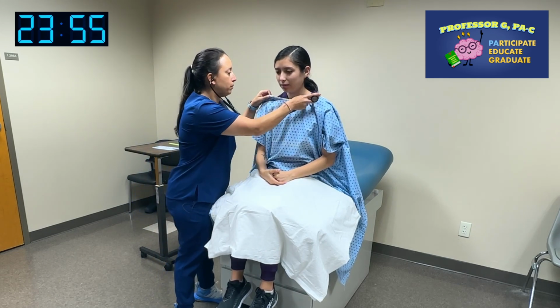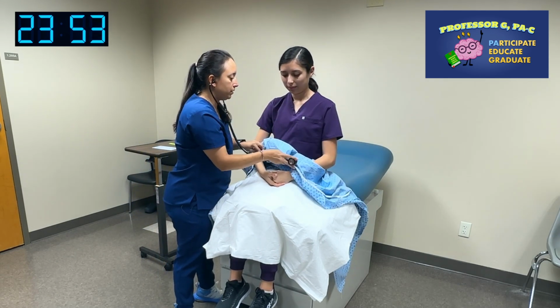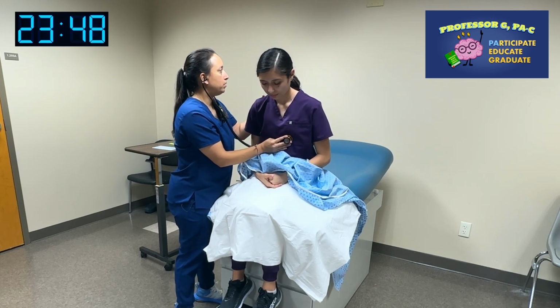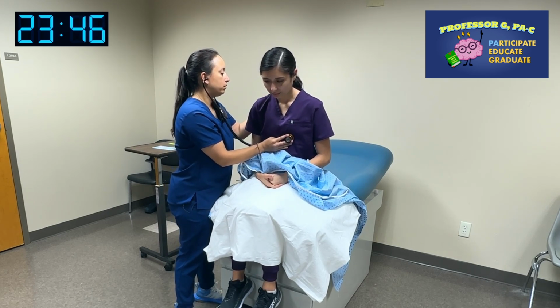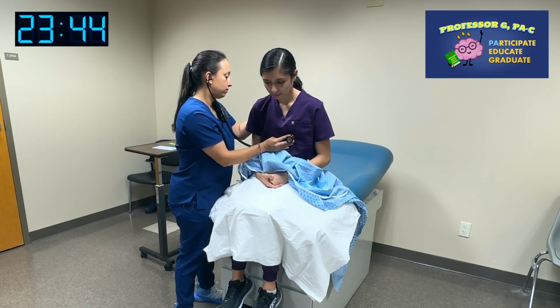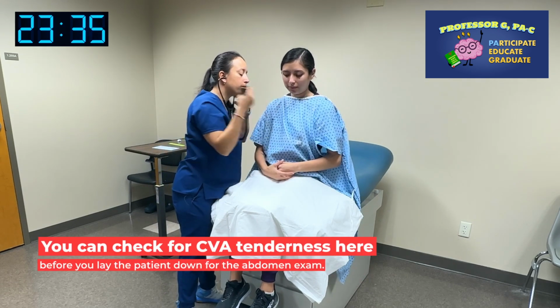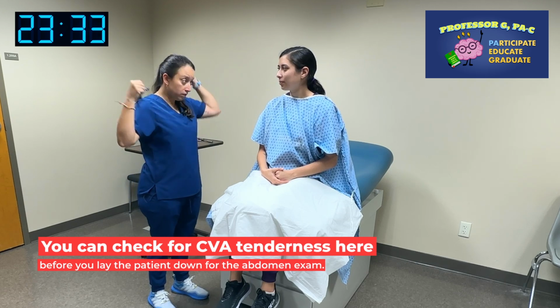I'm going to pull this down one more time. I'm going to listen right around here. I'm going to have you lean forward. And I want you to breathe out all the way and hold it. Okay, you can breathe. Put this back up for you. All right, and that completes the heart exam.